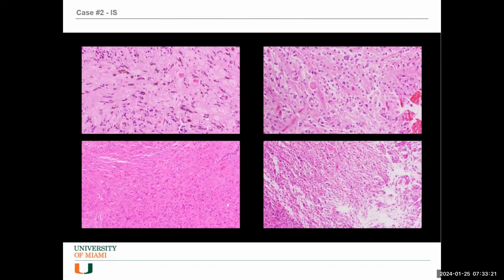On the left upper here, you see evidence of previous hemorrhage. So there are some microhemorrhages sometimes that happen. They may be asymptomatic within the tumor. I have seen 2 cases of pilocytic astrocytoma in a child presenting with hematoma to the ER. So that can happen. Pilocytics can clinically be bleeding tumors rarely, in my experience. And the rest shows the same. No mitosis, no necrosis. Sometimes some vascular changes can be seen, but not like a glioblastoma type vascular morphology.